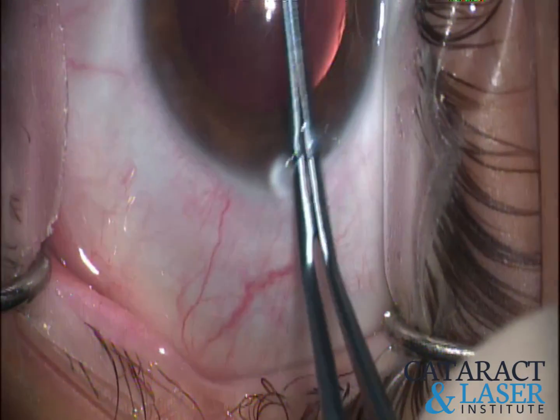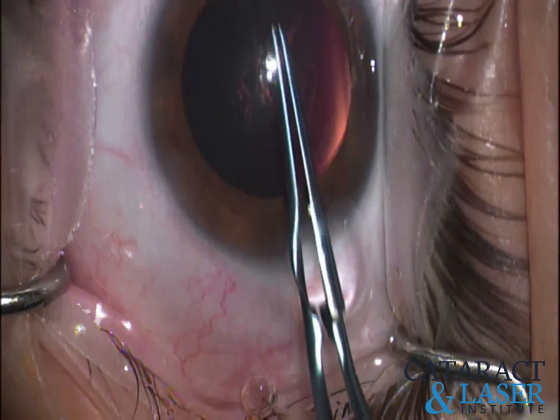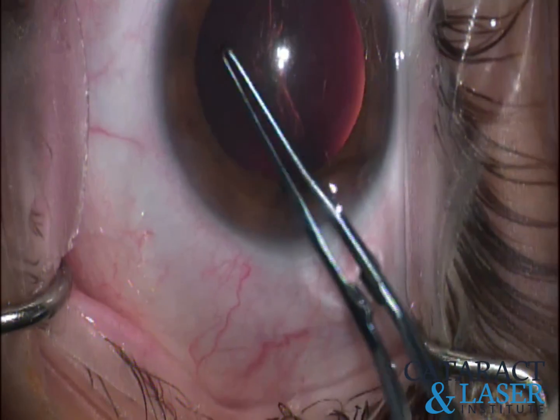Here, I like to use these micro-utrata forceps — I feel like they just have a nice feel. This is the titanium version. With just a couple of grabs here, you can do the entire 360-degree rhexis.